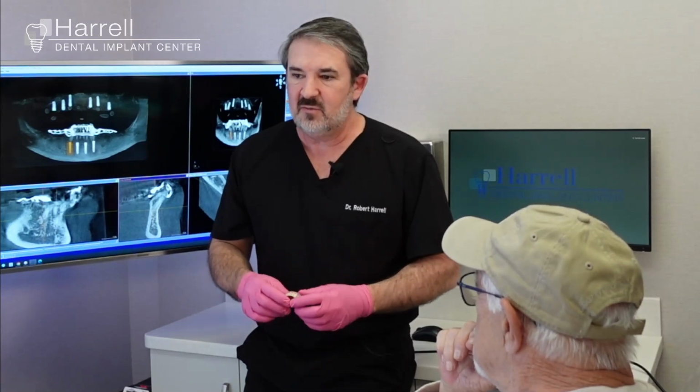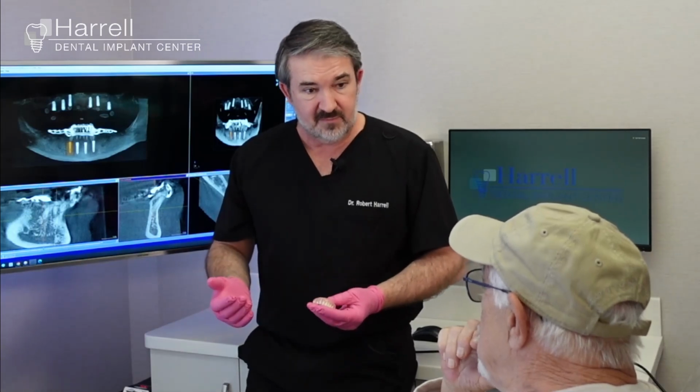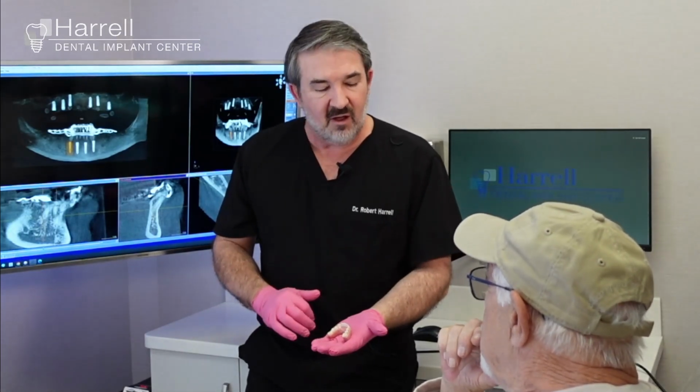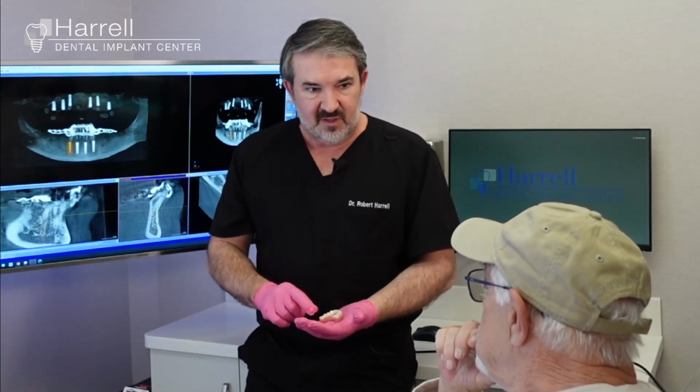But it's generally not a long process. We generally don't see patients that have major concerns. Everybody says within about 2 to 3 weeks they feel natural. They feel like a part of them. Yeah. It's different because it's one solid piece versus 12 or 14 individual teeth.